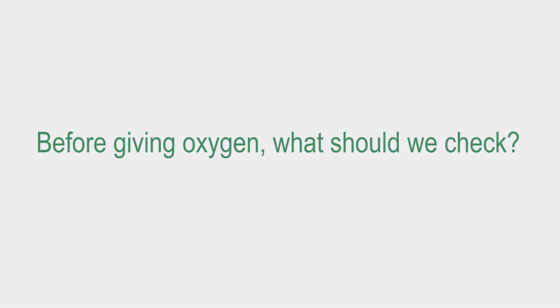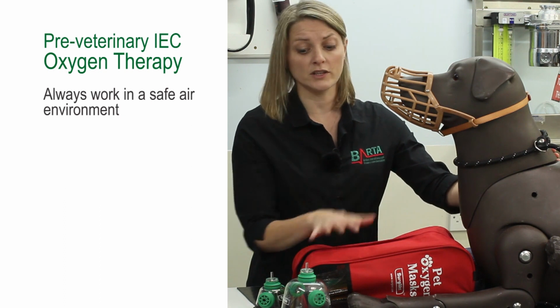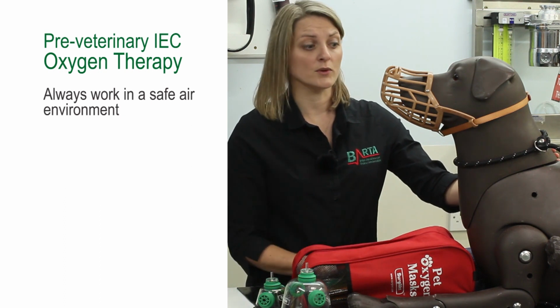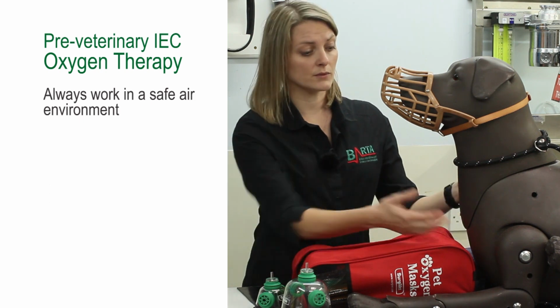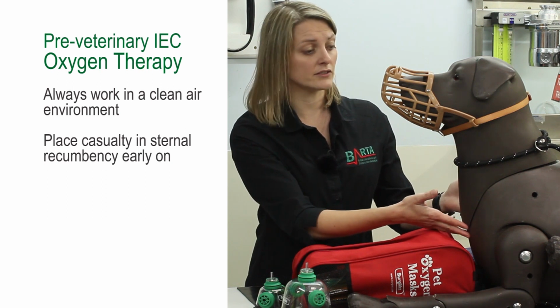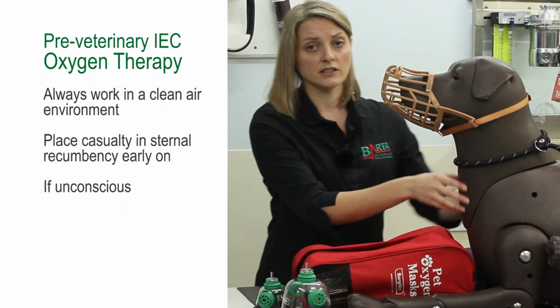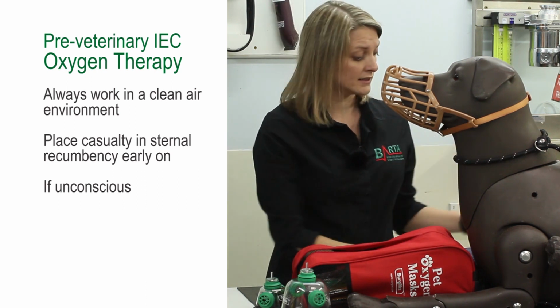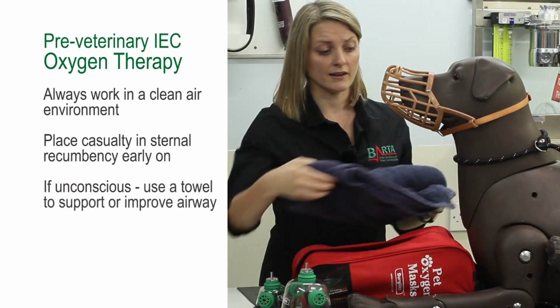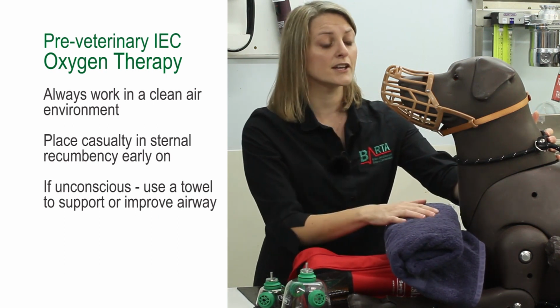So once we've retrieved the animal and got it into a safe air environment and somewhere safe for us to be working, we want to just think a little bit before we use the masks about what's going to be appropriate for this animal. So improving its airway to start with, we suggest putting the animal into sternal recumbency, where they're sat up like this on their chest. If they're unconscious, obviously the head might be slumped forwards, and to improve the opening of the airway, you can use something such as a rolled up towel just across the front here for the head to be supported on, so lifting and opening the airway.